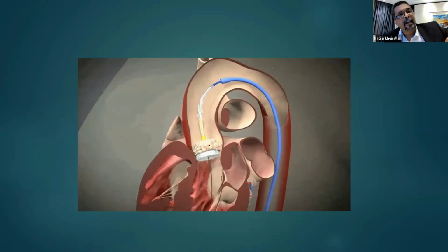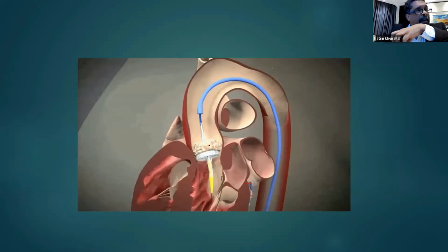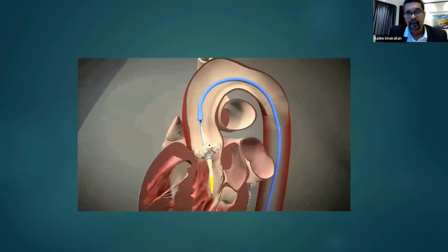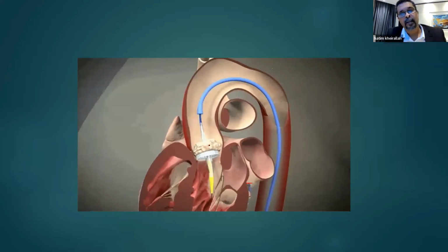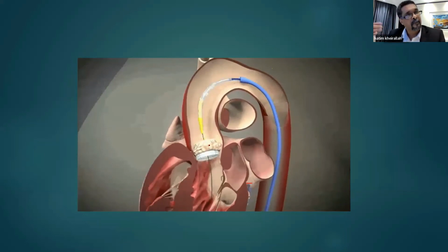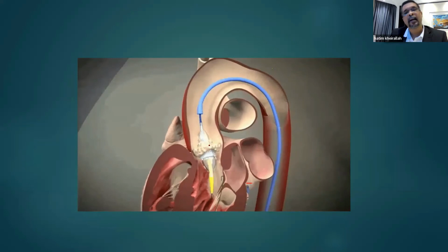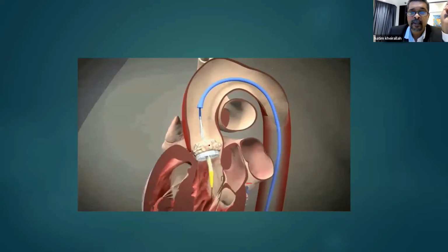It's not valve in bioprosthesis. Valve in bioprosthesis is easier because the platform provided by the old valve is solid enough to take the new prosthesis. But the MAC and the ring are not. But they are also done: valve in MAC, valve in repair ring, and stuff like that. So this is valve in valve. Again, high surgical risk patient.